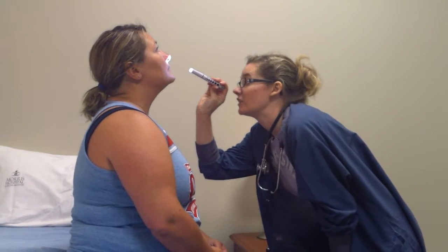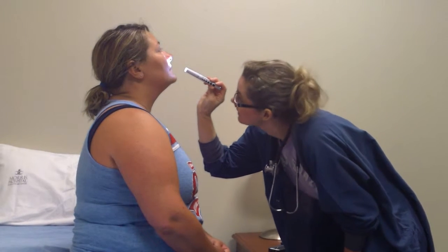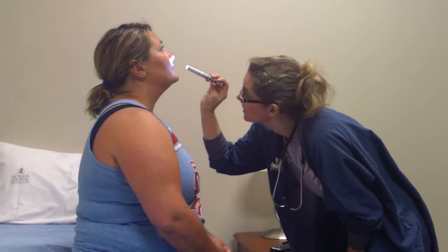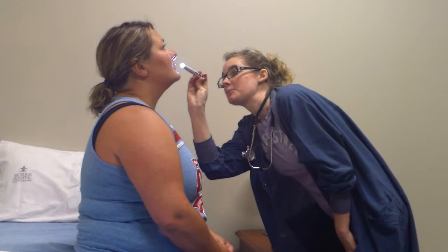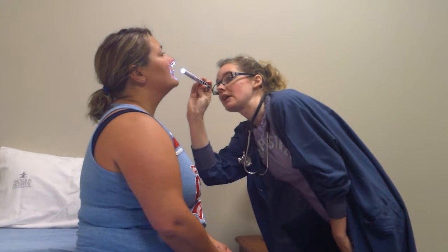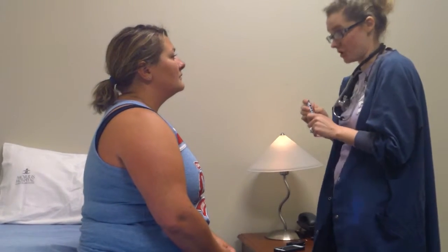I can see bilaterally that your nares are patent. I can see the inferior turbinates. I can see that the mucosa is pink and moist and there are no foreign bodies present. The columella is midline. The septum is centered. There's no signs of perforation or deviation.